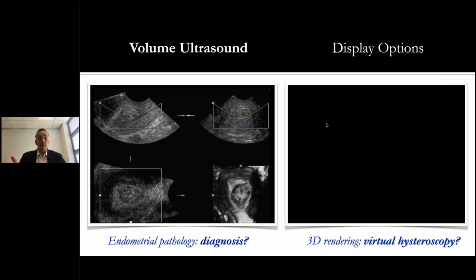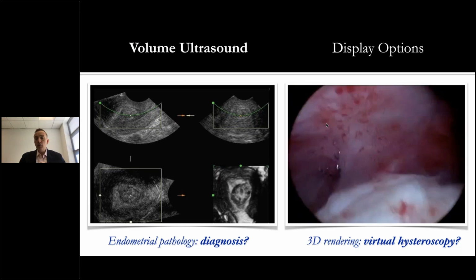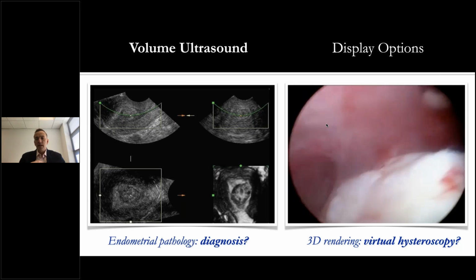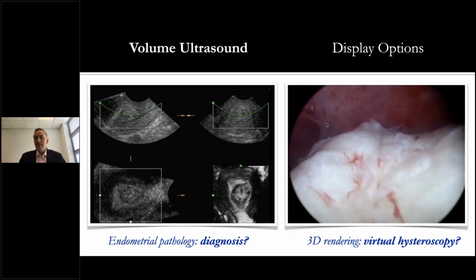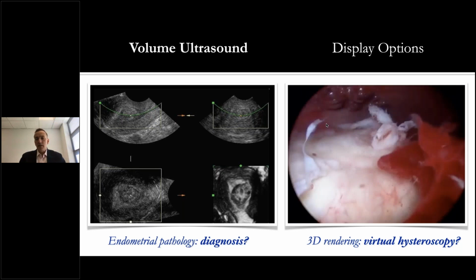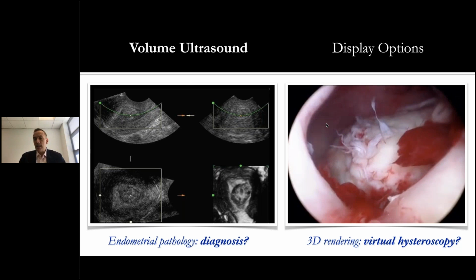So pretty clear here, there's a very large submucosal fibroid with a broad base. I like to show these pictures side by side because if you're not the surgeon, you couldn't really describe this fibroid to show what you're likely to find in hysteroscopy. But if you printed off that rendered image or the coronal plane, it is identical to what you see with the hysteroscope. So a big bosselated intracavity fibroid, very, very easy to remove. You don't need more than 10 to 15 minutes to do this. No point in down-regulating the patient.